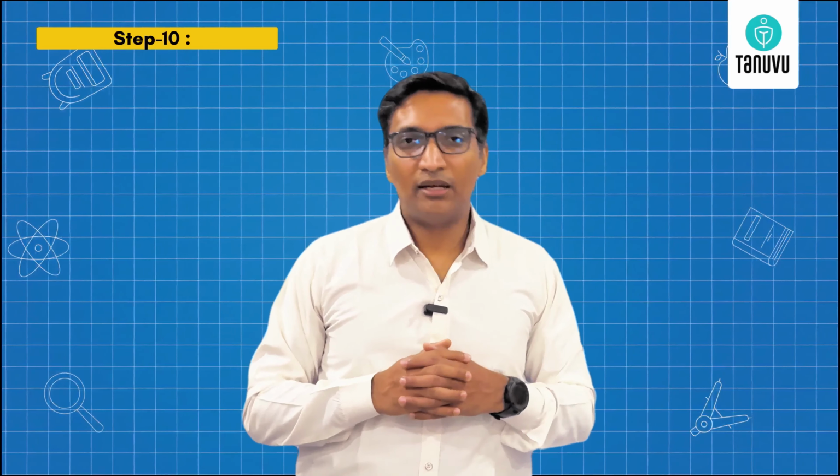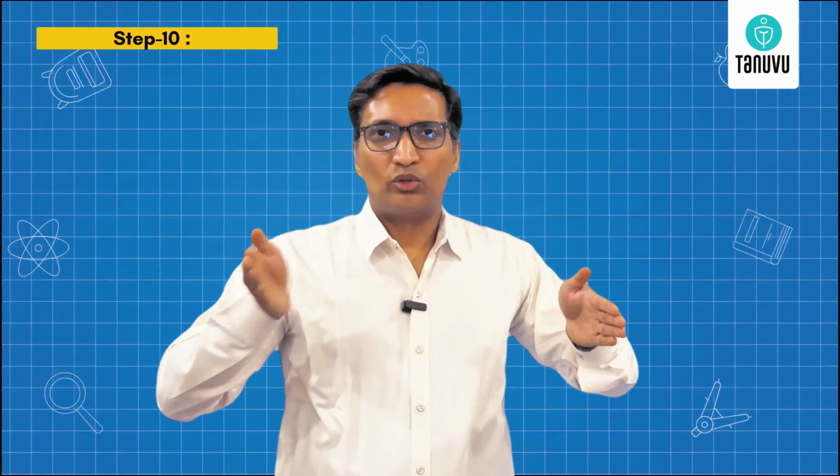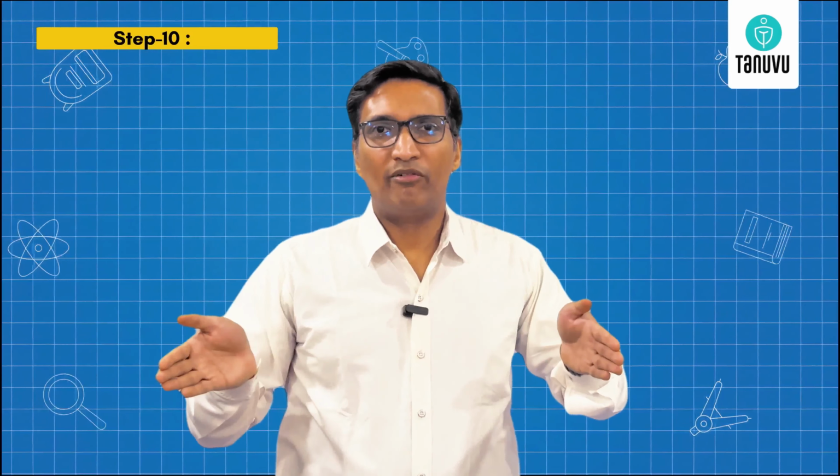So that concludes the ECG. I hope it has been a useful session for the residents. Going through from step 1 to step 10 in a systematic way helps you pick up most of the common abnormalities in ECG and clear your exams successfully.